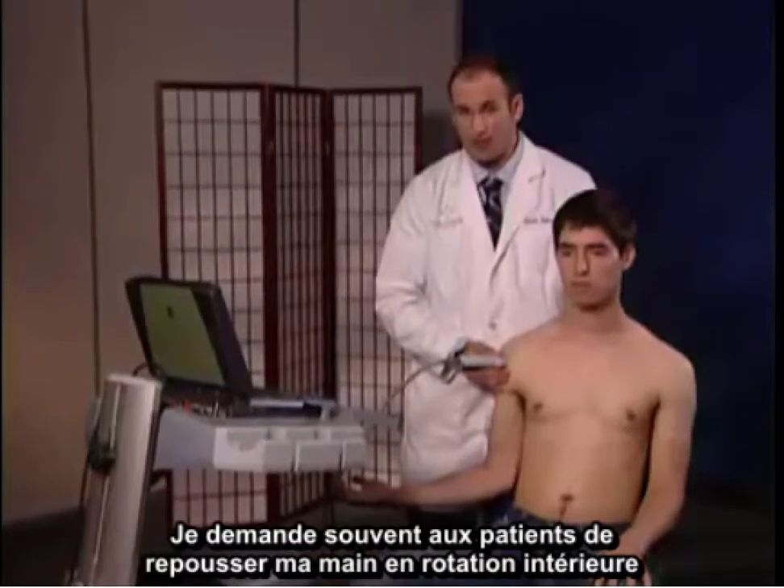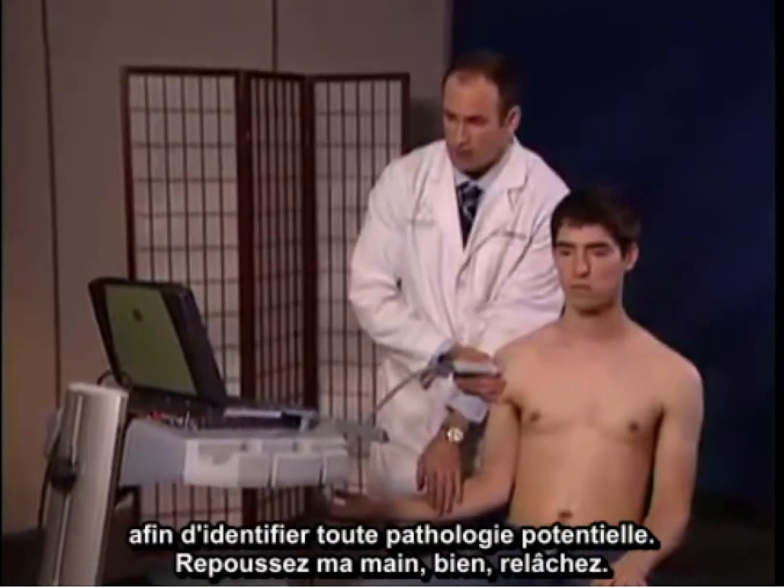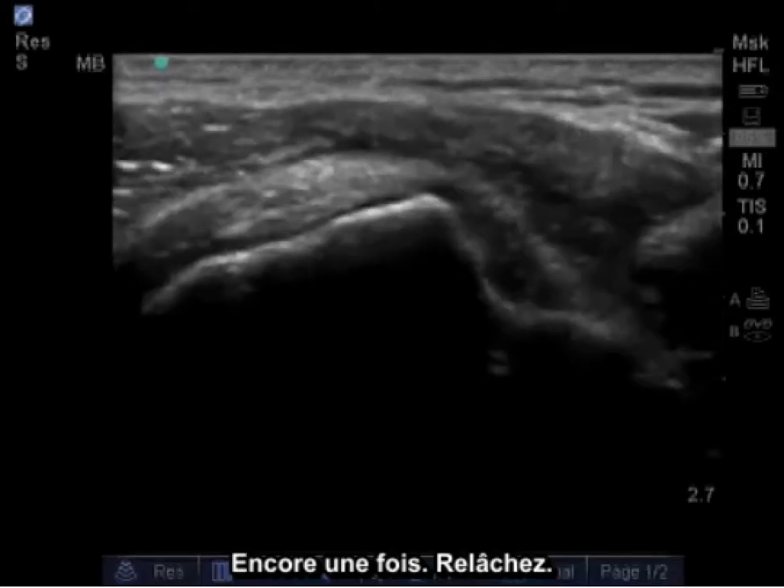Oftentimes, I'll have the patient resist against my hand in internal rotation to detect any pathology. I'm going to push against my hand. Good. Relax. And again. Relax.